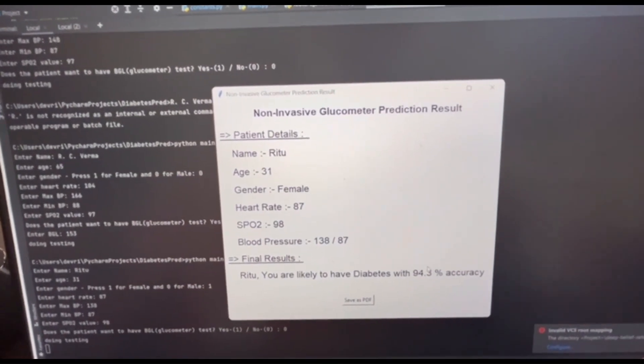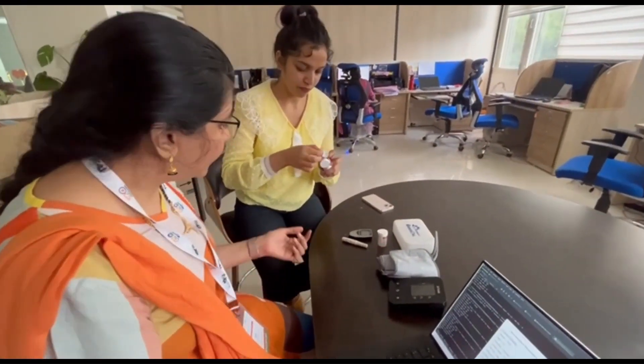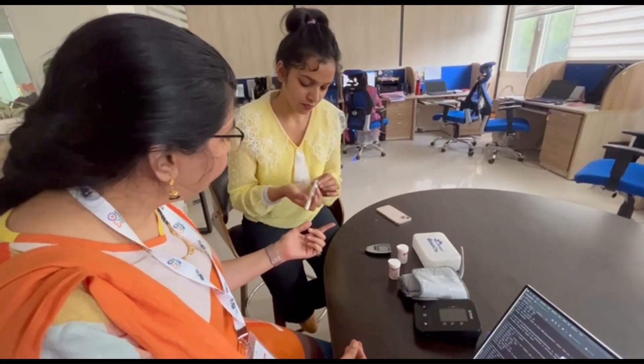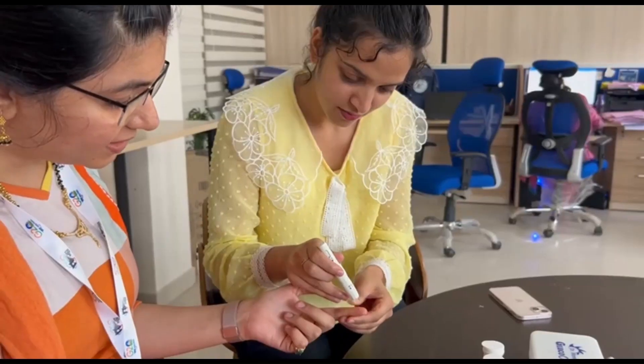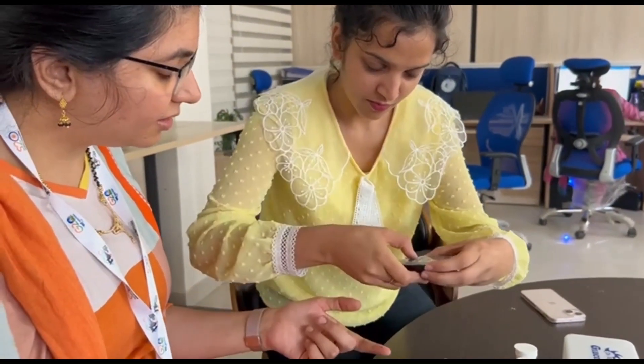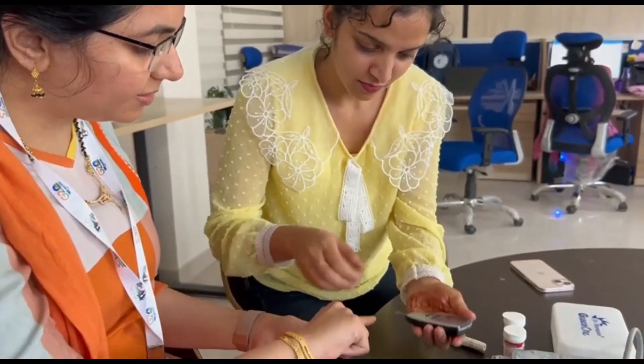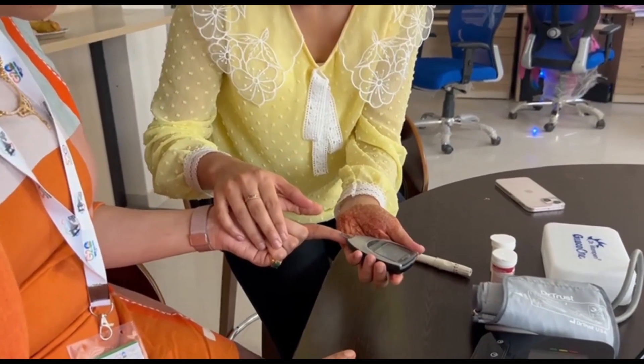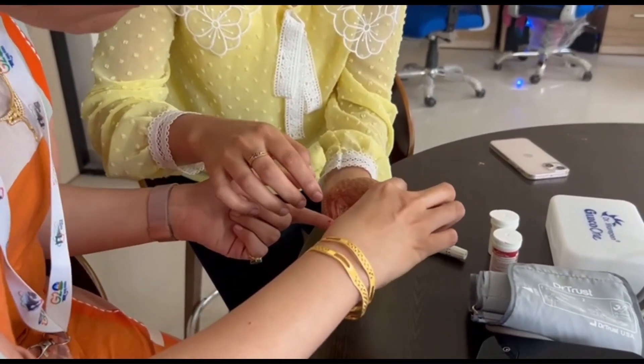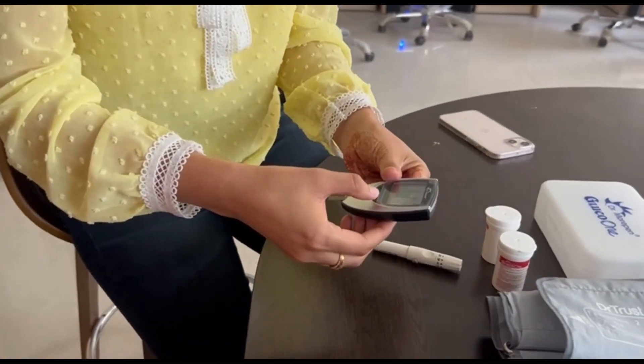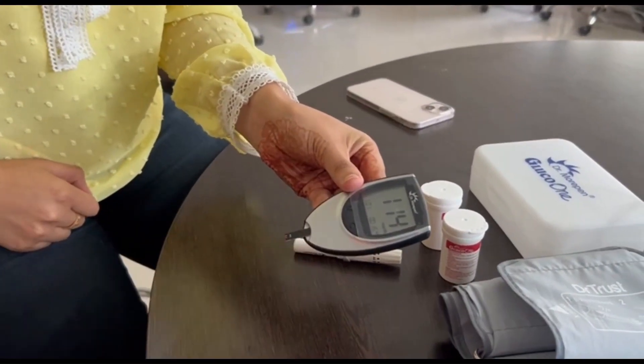Now, let's validate the same using the prick test method. We clean the tip of the finger using an alcohol-based solution and we'll be pricking the finger with a lancet and we have a blood drop ready. Now, we'll insert the test strip in the device and put the blood drop onto it and we are getting the BGL as 114 which is a borderline or pre-diabetic case.